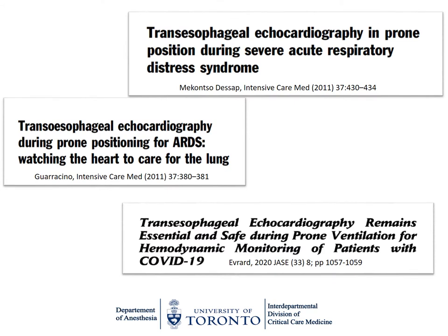So if your patient's extremely unstable and also doesn't tolerate to be put back supine, you may have to perform your transesophageal echo in the prone position, and that's been described, and it's not been shown to be more dangerous or more complicated. In a series of cases, they actually showed that the insertion of the probe was quite straightforward.